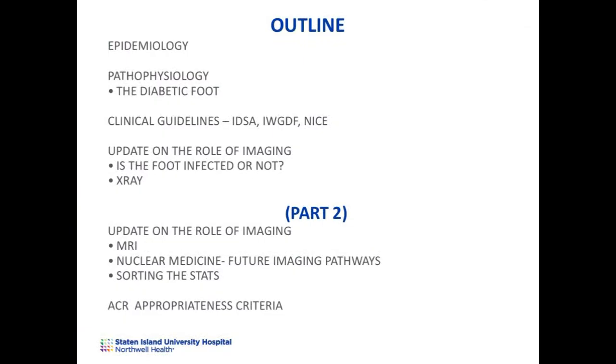In Part 2, we're going to follow up on the pathophysiology with an update on the role of imaging. We're going to look at MRI, nuclear medicine, and future imaging pathways. We're going to sort the statistics. And then finally, we're going to finish with American College of Radiology appropriateness criteria with regards to imaging of the diabetic foot.